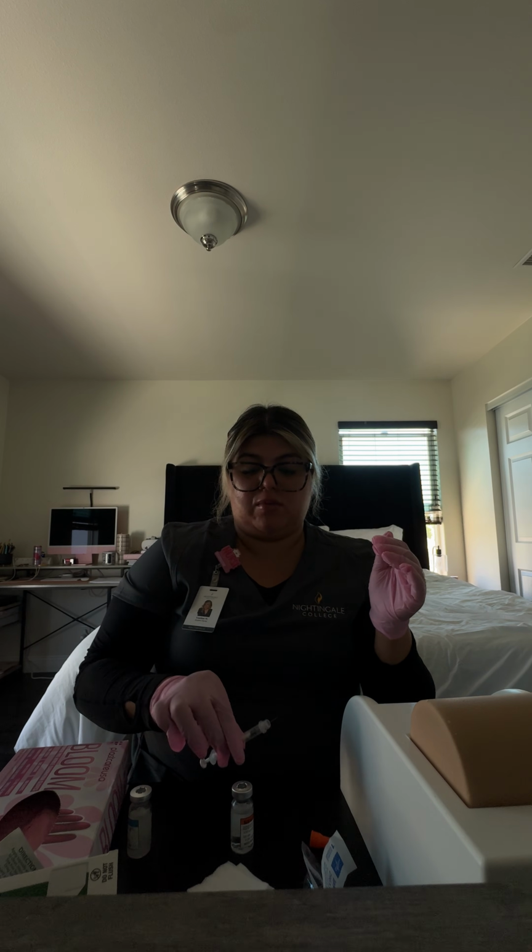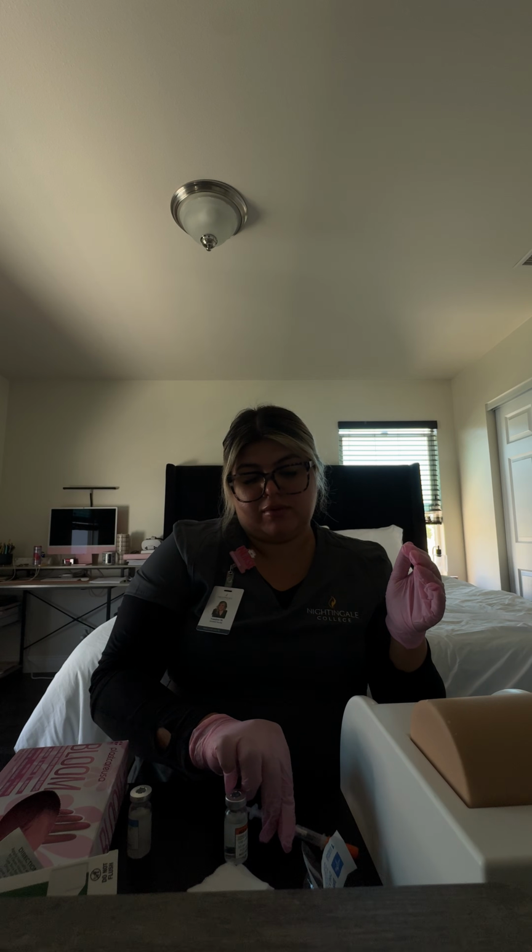Once we have confirmed with the EHR that we have 12 units, we can go ahead and cap the needle using the one hand scoop technique. And then put the syringe down. If we do prepare this medication not at bedside with the patient, away from the patient, we would label the syringe with the patient's name and the 2 insulins on it, and then put it aside.